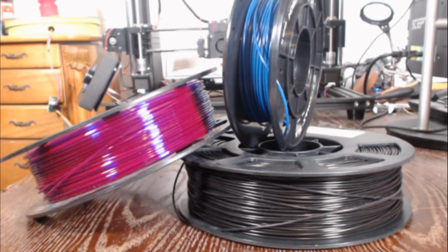And the main one is going to be the filament that you use. Now, taking a look at these three filaments that I have before you, I have one PETG, that's the purple. There's an ABS in black, and there is a blue that is a PLA. Now, all three of these are 3D printing filaments that are pretty common, and none of them are really adequate for making a permanent reusable mask solution. Now, in this instance, I personally did use the PLA. It is the blue PLA. This particular one is from 3DX Tech, and it is some very high quality stuff.